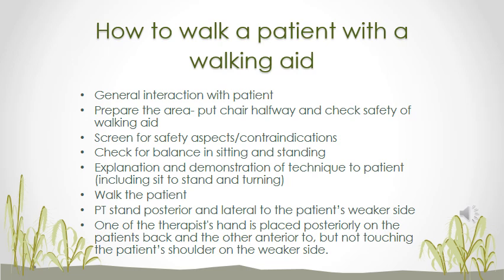So you'll first have to explain in words, then you will have to demonstrate to them, then you have to teach them again. Thereafter, check their balance in sitting and standing, measure the walking aid to fit them perfectly, and then they walk. So let's go through this point by point.